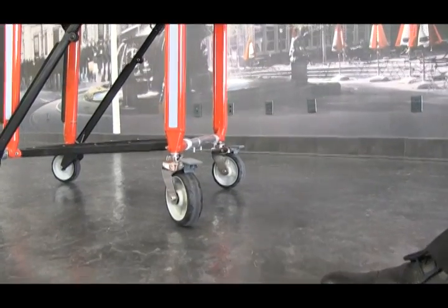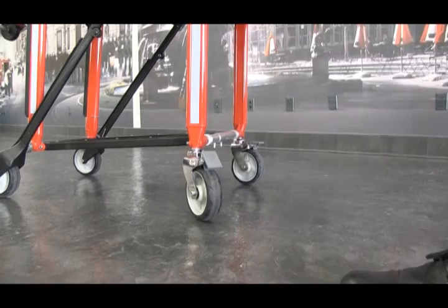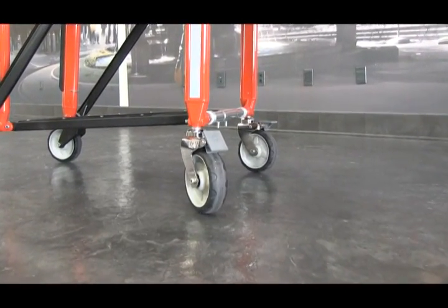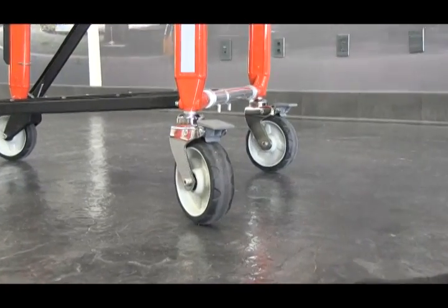To engage the wheel locks, press down the lock. That locks both the rotation of the wheel as well as the swivel of the wheel. To disengage the lock, press the top of it to unlock it.